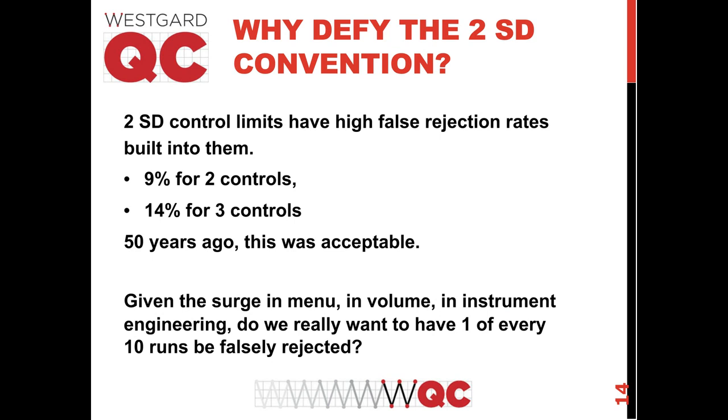To have a 10% failure rate or higher on our QC process, that's really deleterious. It's consuming quite a bit of our time on waste. Because again, this is a false rejection. There's nothing wrong with the system, but the way you've chosen your limits means you're actually creating problems for yourself.